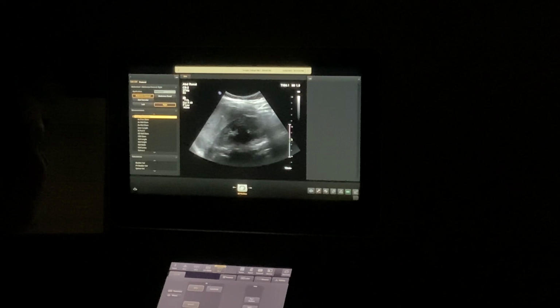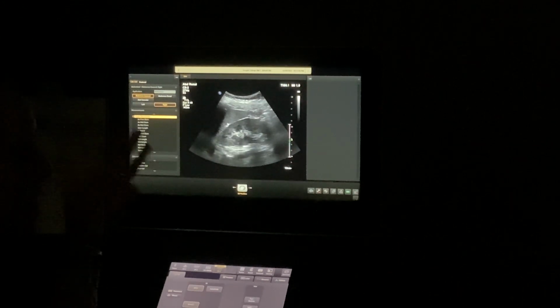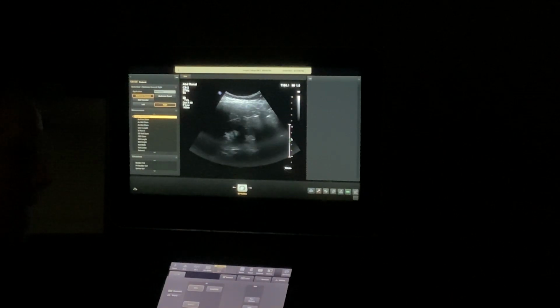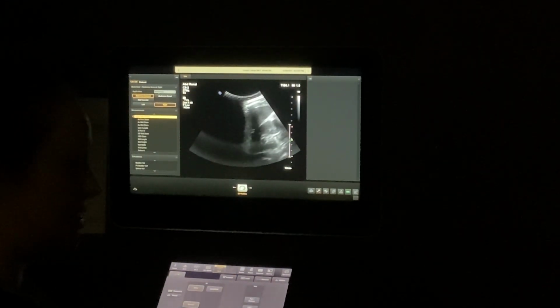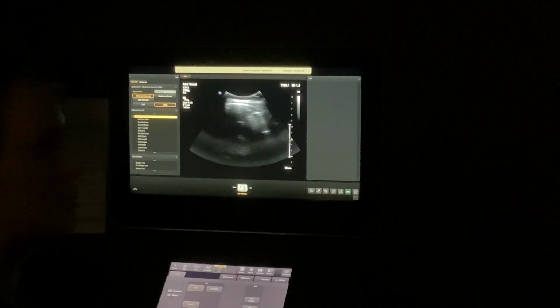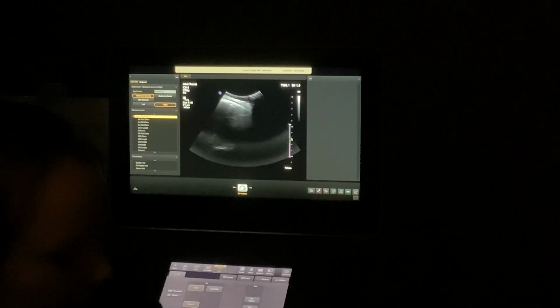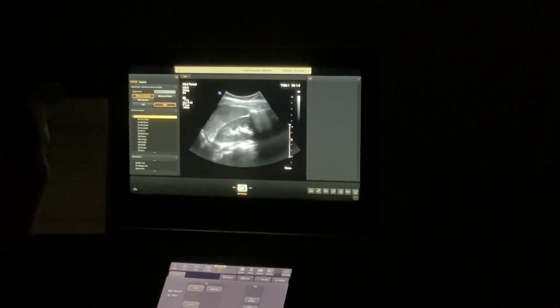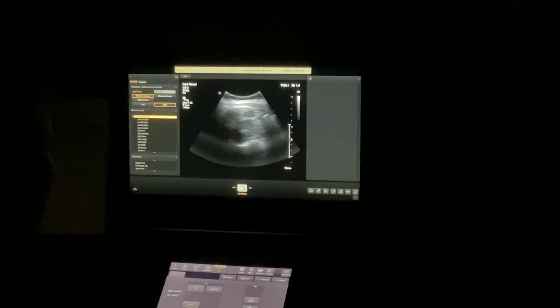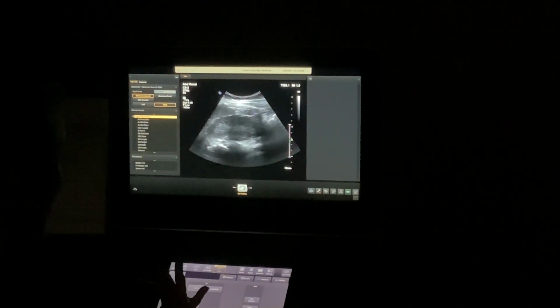So find your good window and use all of the things. Not breathing, deep breathing, half breath, belly poked out, okay? And her position too. She doesn't have her rib cage all kinked up here with her hip bone. She's nice and straight and stretched out. If you need, push that leg to the back. Yep, just like that. Opens up this space a little bit more here, okay? So keep that in mind when you do that. Every single time you move your patient, it might change how things look.